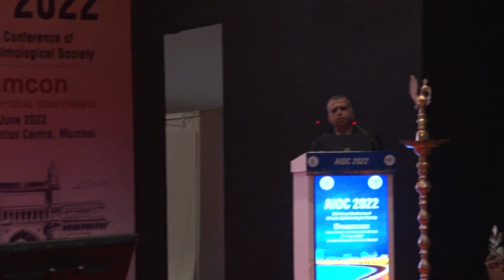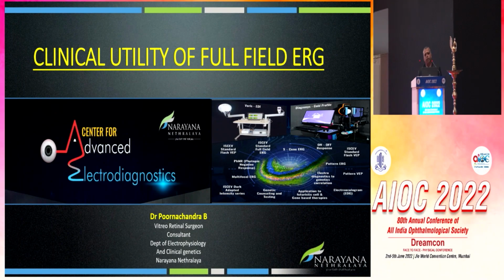And ma'am, since there might be a lot of ERG being done, is there any published literature of the standard data in the pediatric age group? It is there. It is there. Is that the RETeval device? Yeah, it is there, and also the publications by Anthony Robson, in there you also have a pediatric ERG protocol.